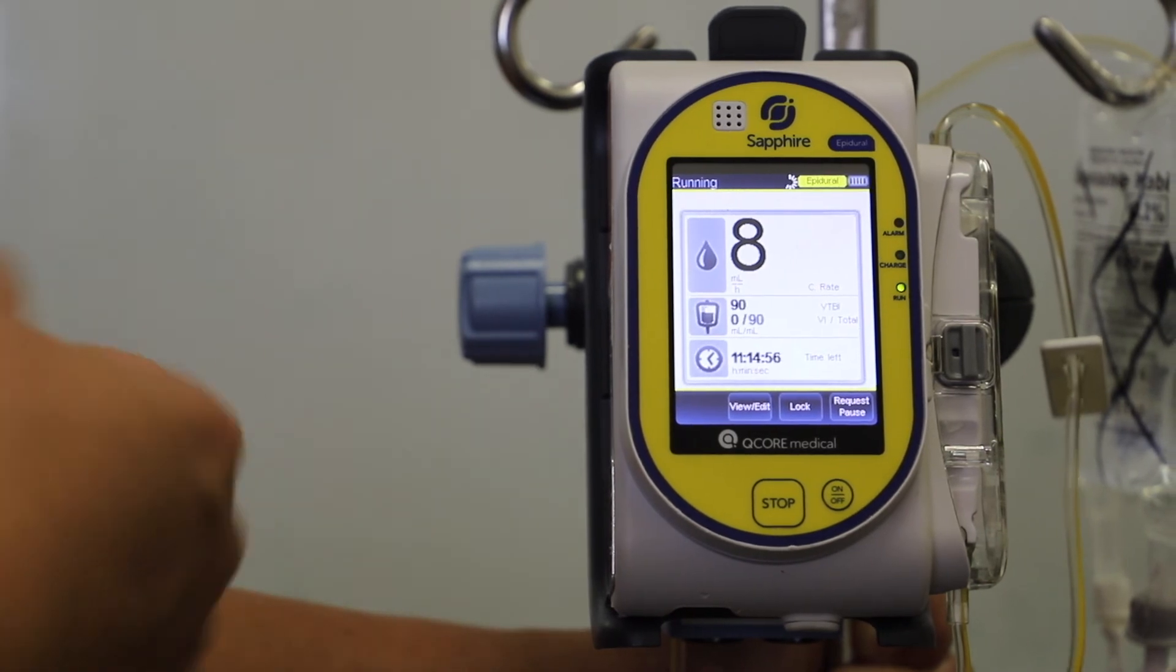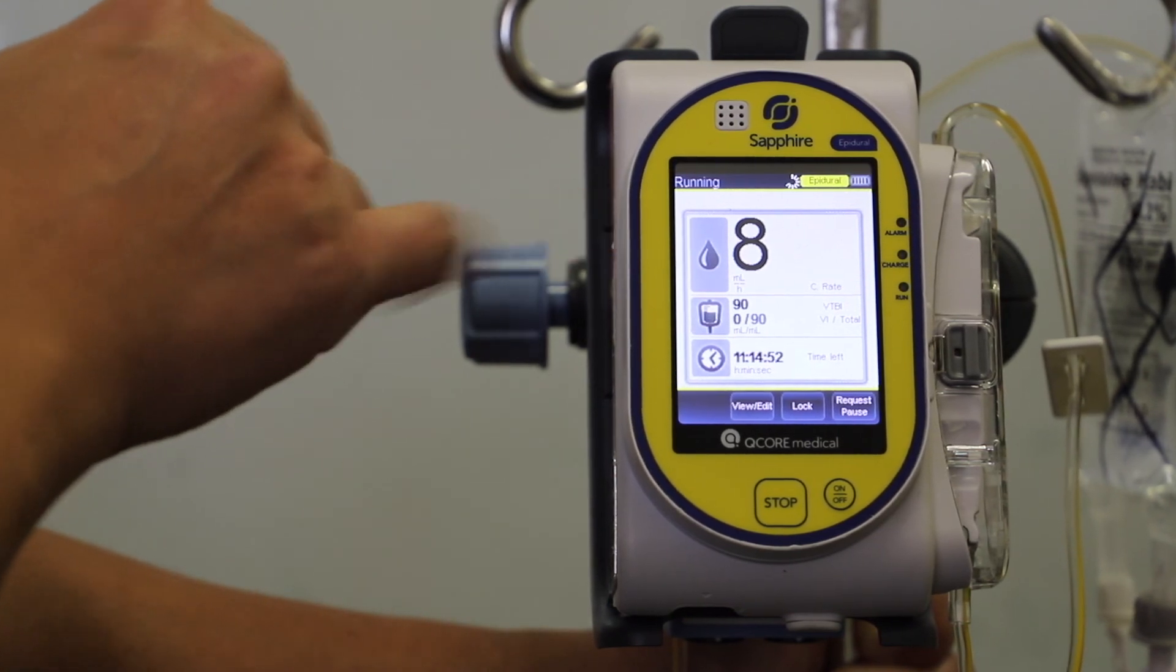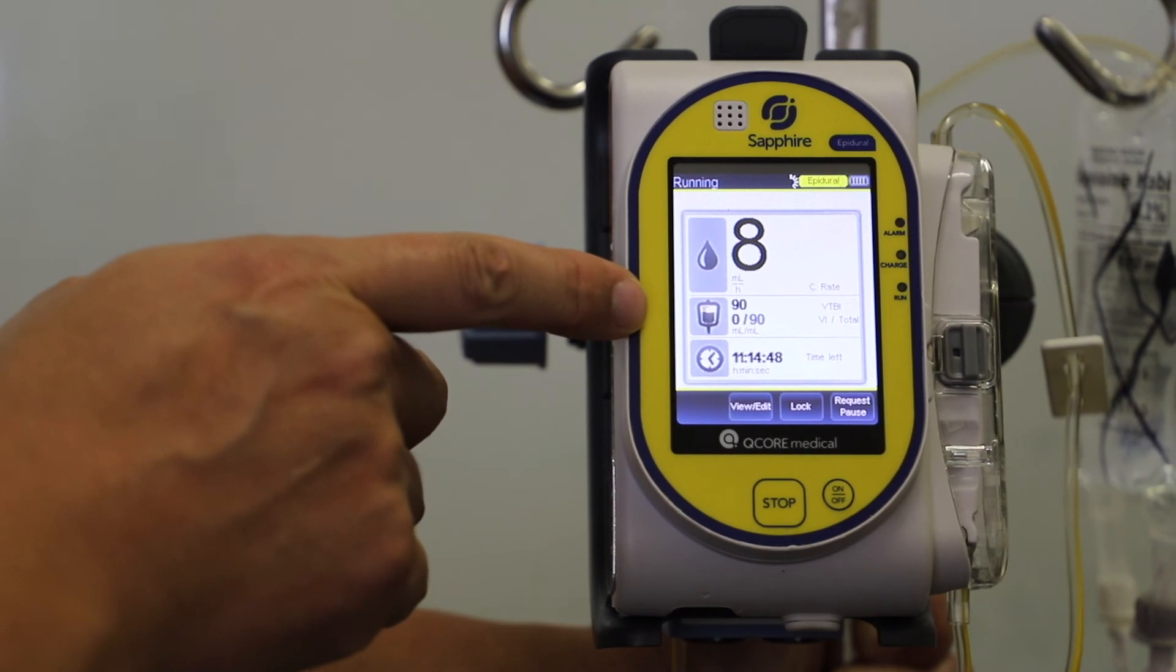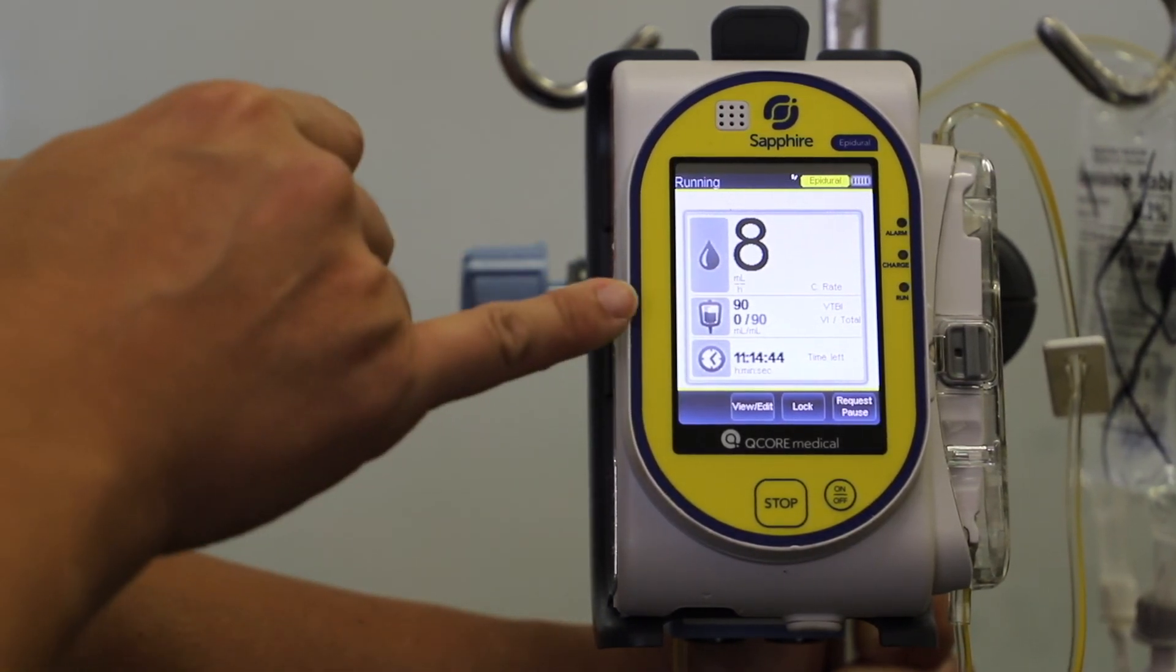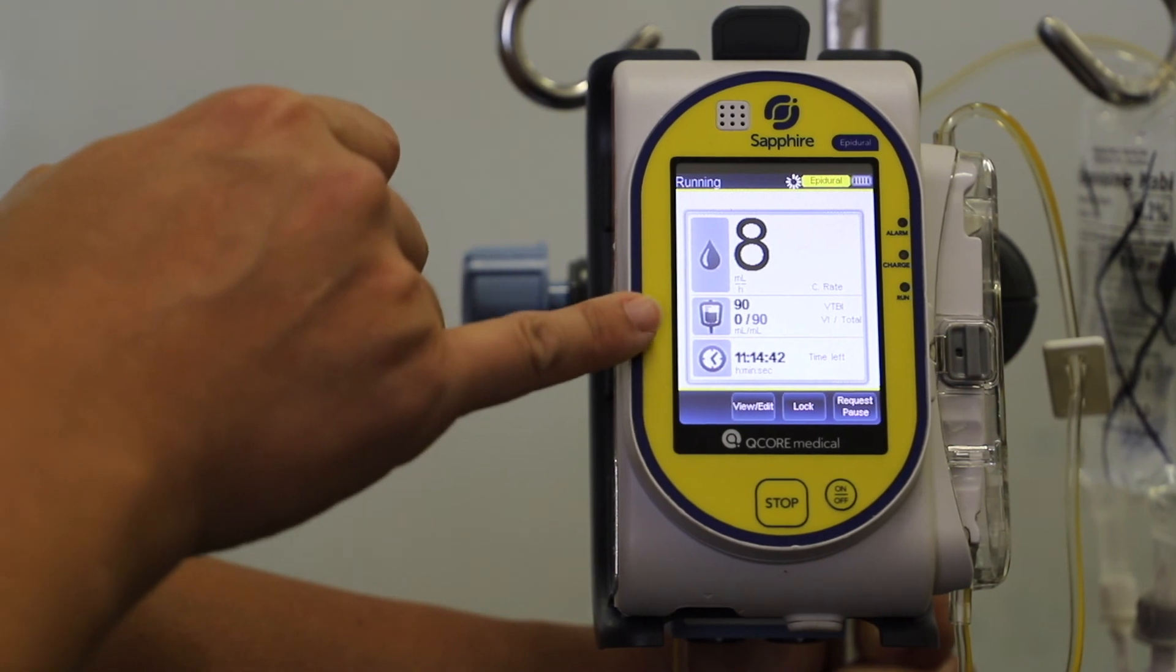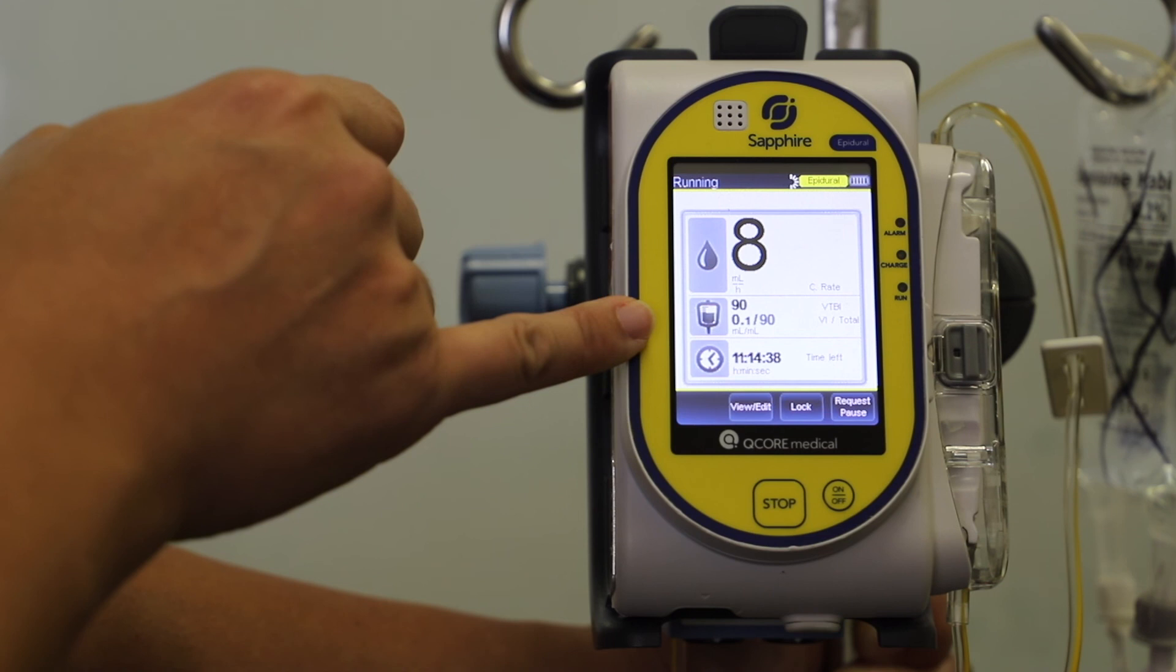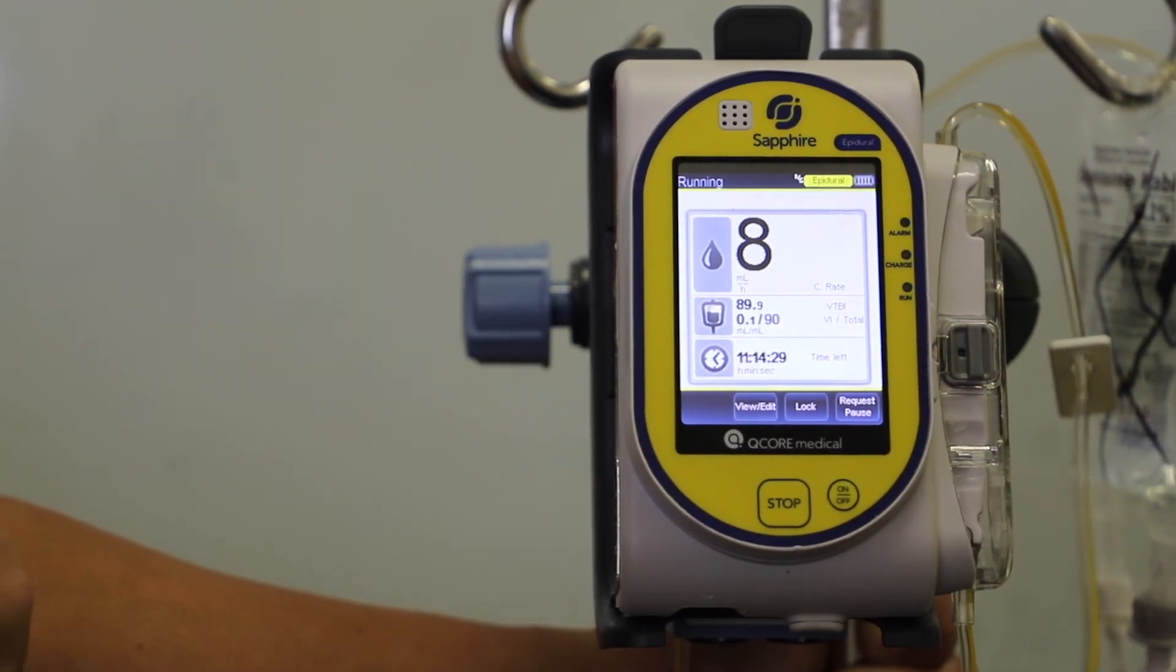So when it's running, it will have a big, bold number that it's running at a continuous rate of eight mils an hour. In the second box here, it indicates volume to be infused, which is 90, and how much has been infused in total. So 0.1 mils has been infused so far of the 90 mils, and it'll count down with the time left.